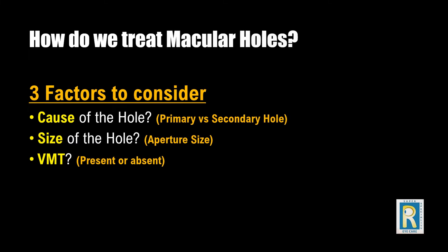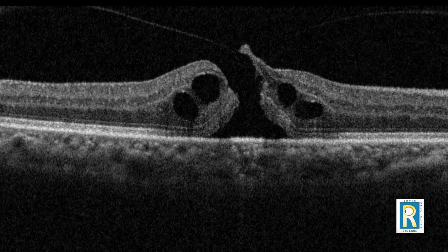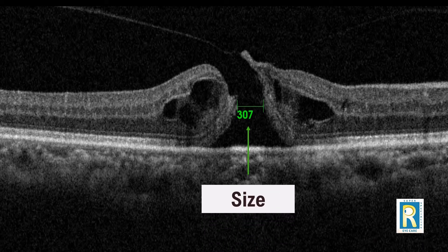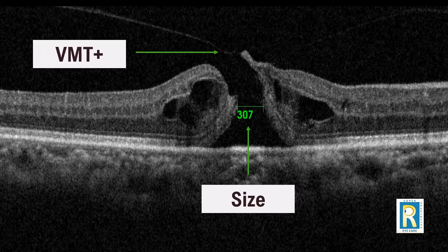Here is the OCT scan of a patient showing a full thickness macular hole. This patient had no prior reason for the macular hole, so this is a case of an idiopathic or primary macular hole. The size is measured by measuring the distance in the middle of the hole — in this patient, the hole is 307 microns wide. The OCT also shows that vitreous is still attached to one of the edges of the hole, so we diagnose it as a macular hole with persistent vitreomacular traction, or VMT.